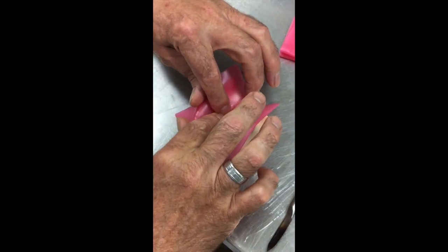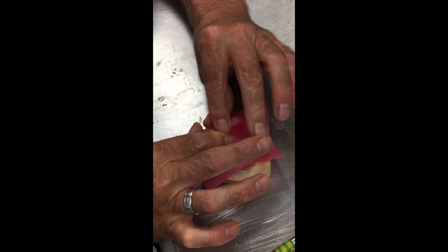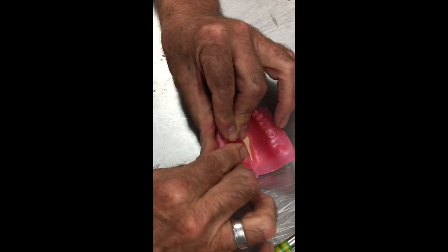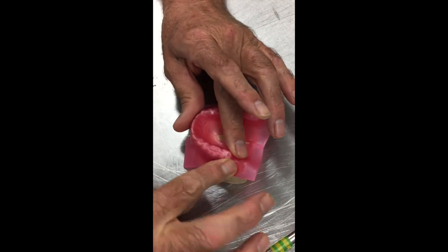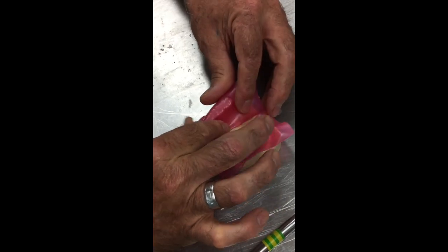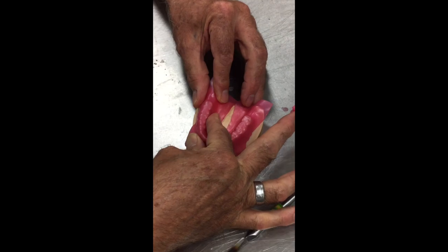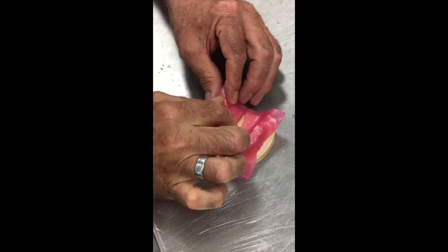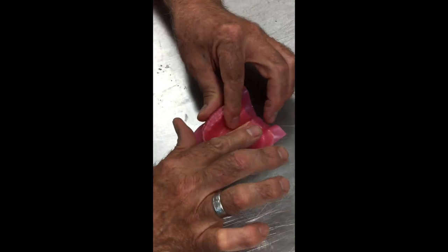You can see how I just tore that up the center, and now I'm just going to make sure it's adapted over my line. I don't want to press this thin in any area. I want it to maintain its millimeter and a half thickness of material, but you notice how I'm adapting it to the line that I've drawn all the way around. I find using the thicker part of your thumb and laying your finger along is the best way to adapt. If we use the tips of our fingers, we can tend to push this thin in areas, and then we get an inconsistency.